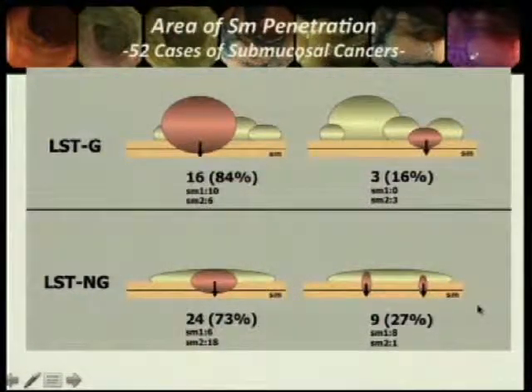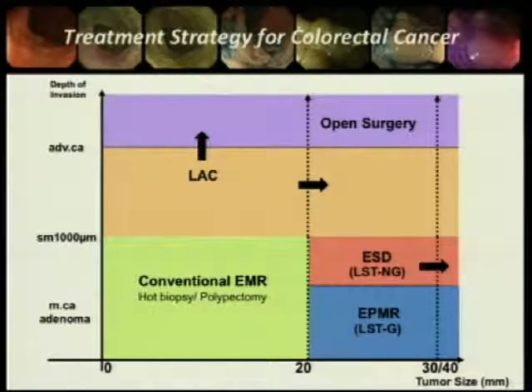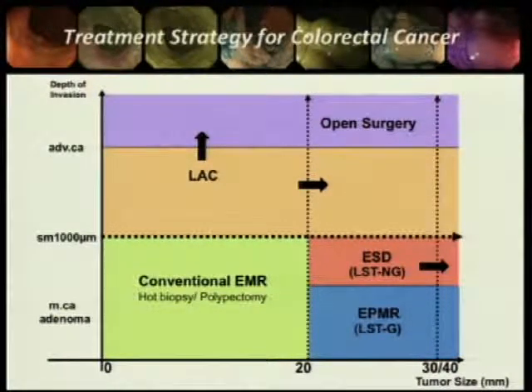using magnification colonoscopy. So our indication for LST granular type could be planned piecemeal resection, resecting the area including the large nodule first, and after that piecemeal. But for LST non-granular type, this kind of very flat region should be resected en bloc using ESD or other technique because of the higher SM invasion rate and also the difficulty of predicting the SM invasive area. So our indication is that SM2 cancer should be resected by surgery.